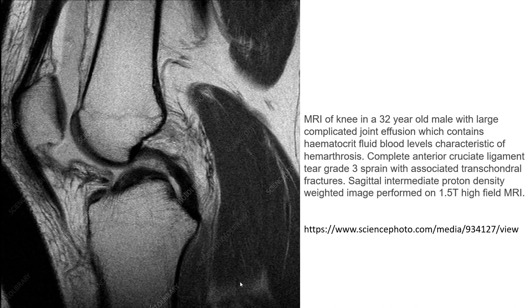MRI case example: 32-year-old male with a large complicated joint effusion, including a hematocrit fluid-blood level characteristic of hemarthrosis, complete anterior cruciate ligament tear, and an associated transchondral fracture. Sagittal intermediate proton density MRI was performed on a 1.5 Tesla system.